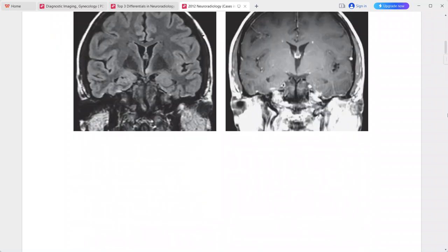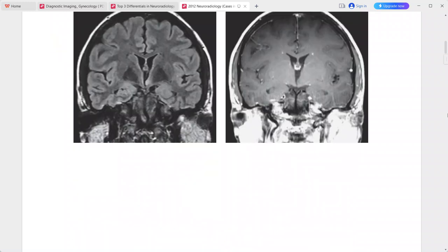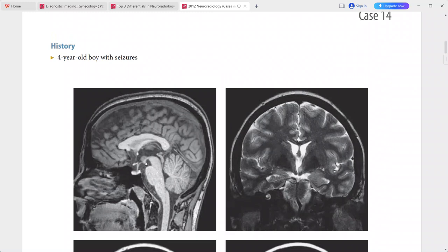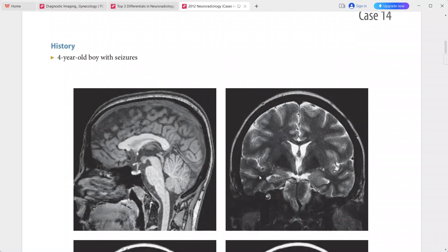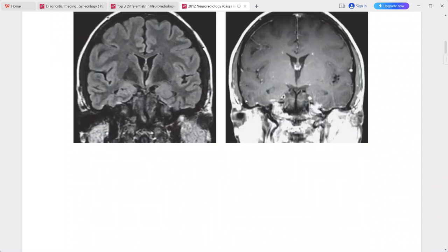Next case: 4-year-old boy with seizures. There is a small round nodule arising from the hypothalamus, adjacent and superior to the left mammillary body. It is T1 hyperintense on the T1 sagittal sequence and T2 hyperintense on T2 sequence.